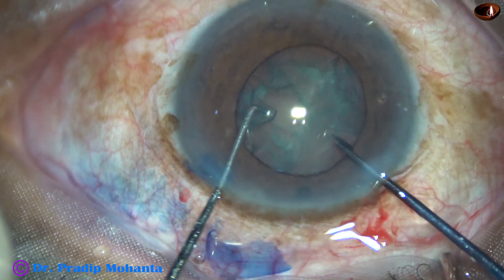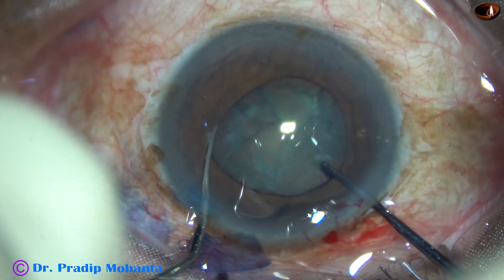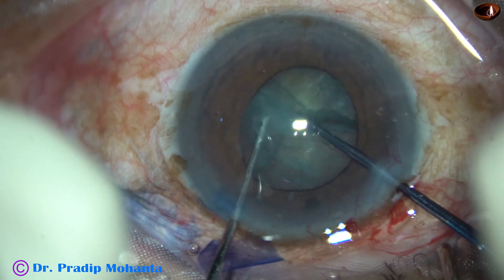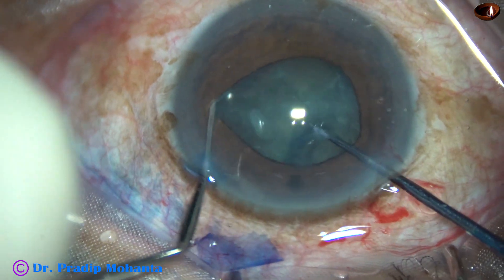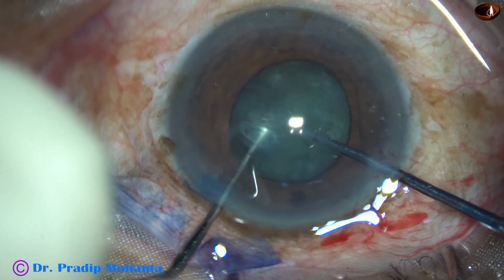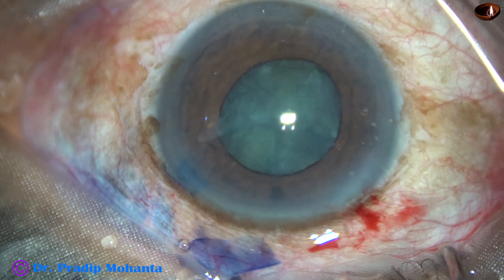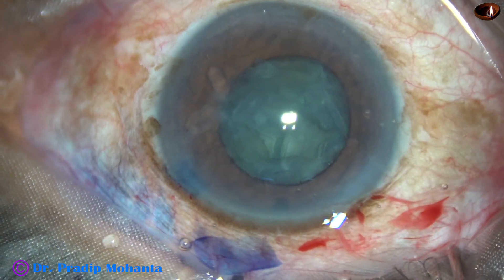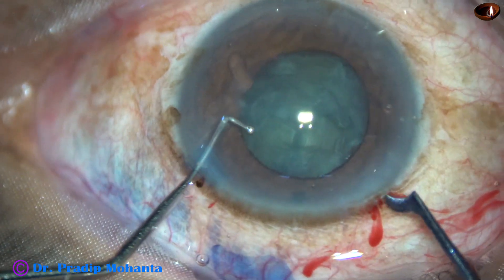This is Dr. Sohail's pre-chopper. I am going to use this instrument to divide the nucleus into two halves, and then one half is being subdivided. The left hand instrument is a blunt chopper with a ball tip all around and it can go beyond the equator safely.